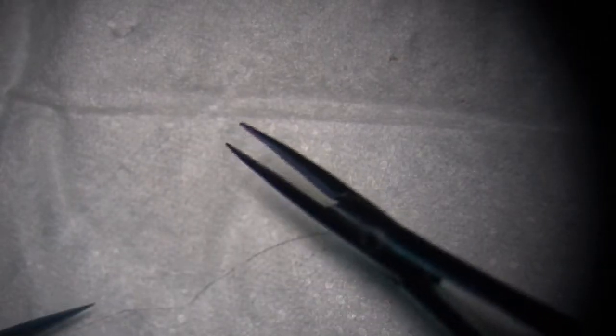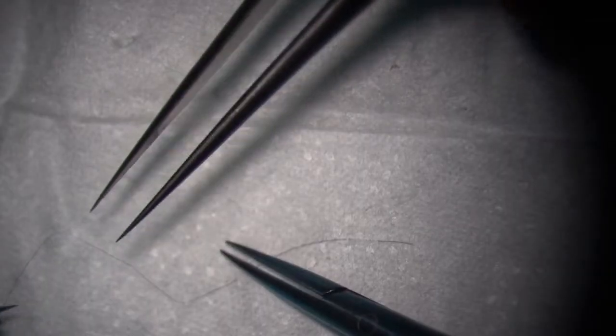So come in, follow the curve. Yeah. And this angle, pull it. Nice. Take this one all the way through. Use your left hand to pull it out. Okay. Yeah, because it's on your left. On my left hand side. Yeah. And then start further away. If you want to avoid crossing the instrument at the first knot, use the needle holder.